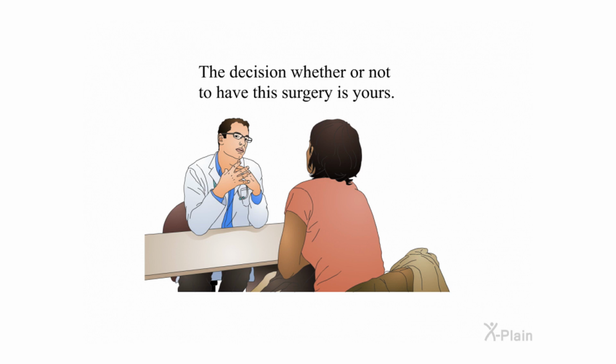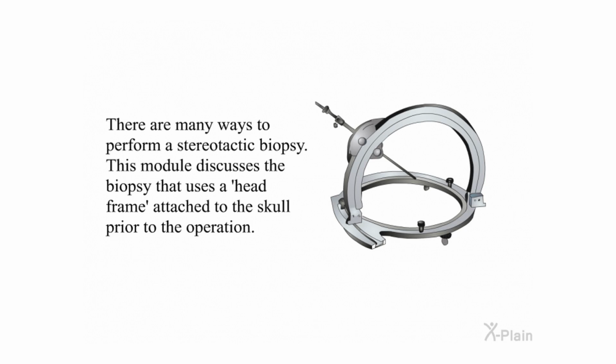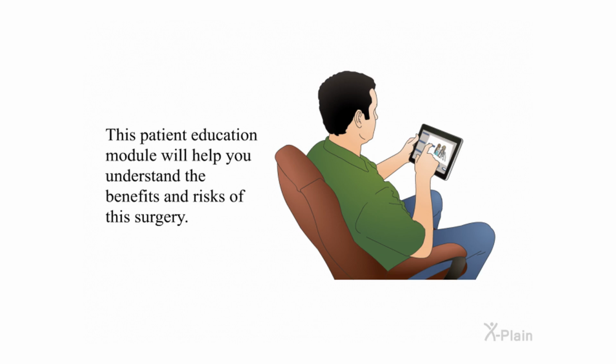The decision whether or not to have this surgery is yours. There are many ways to perform a stereotactic biopsy. This module discusses the biopsy that uses a head frame attached to the skull prior to the operation. This patient education module will help you understand the benefits and risks of this surgery.